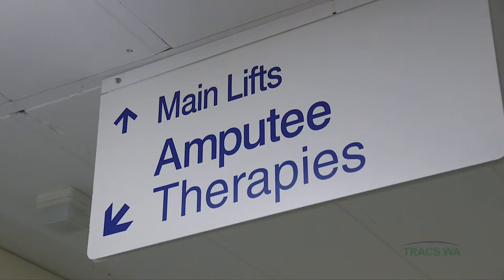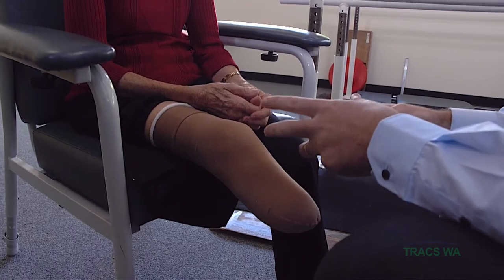In this scenario, 75-year-old Val, a recent amputee, is meeting prosthetist Brendan Cahill for an initial consultation regarding the fitting of a prosthetic limb.